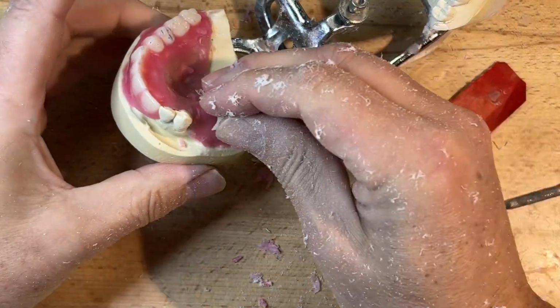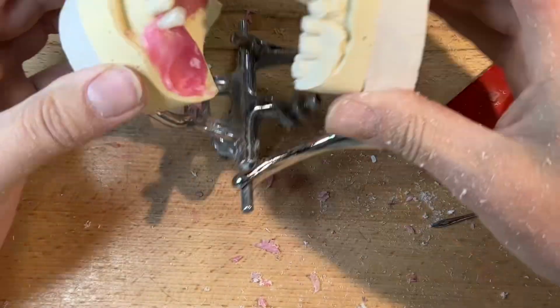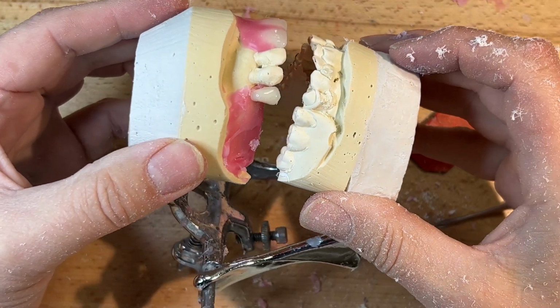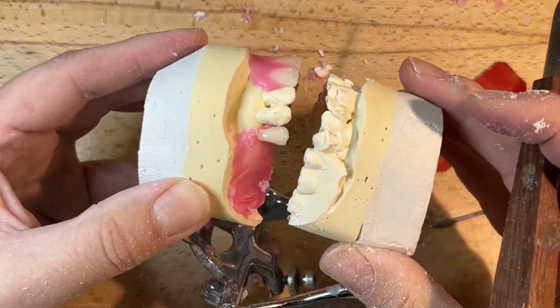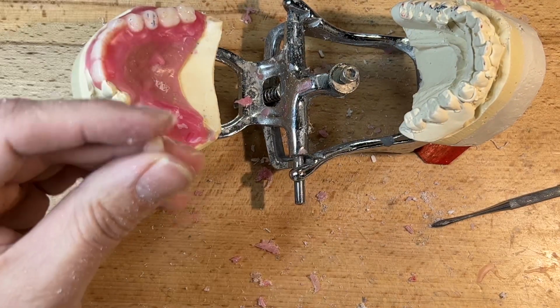Like I said, we're going to go for try-in. Luckily we can go for try-in, and we can have some changes if we wish. Now we can see what's going on here. I wish I had the lower partial. I would probably reduce the mesiobuccal line angle of number 4-5 here to get better interdigitation, but I'll have to customize upper 4.